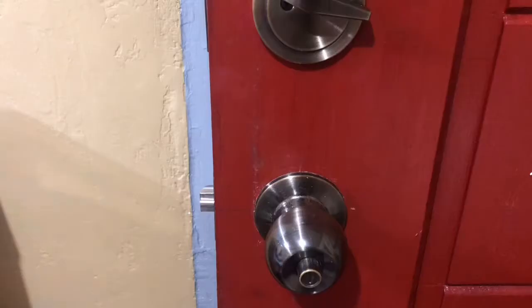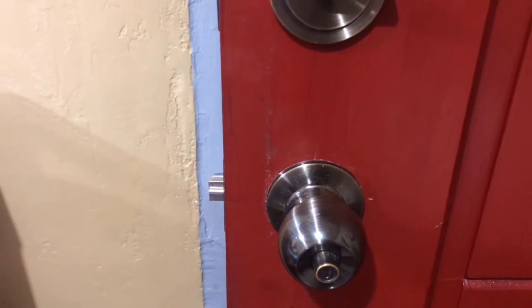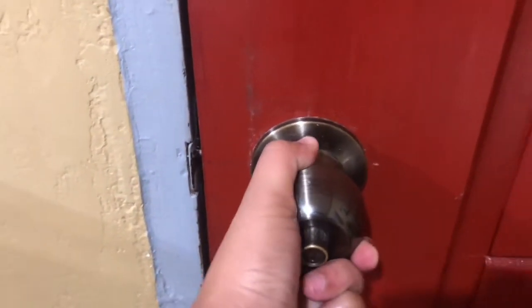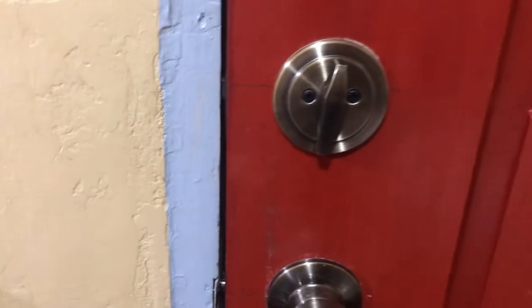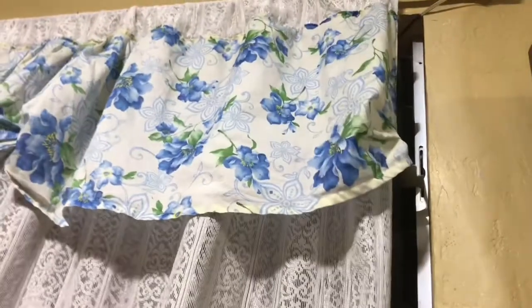Provide a good light. Provide for privacy by screening and closing the door or windows. Replace the top sheet with a bath blanket.